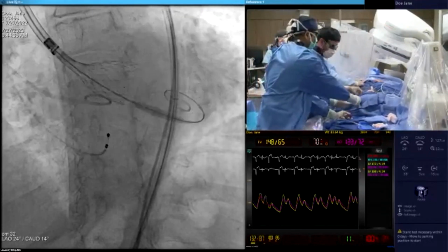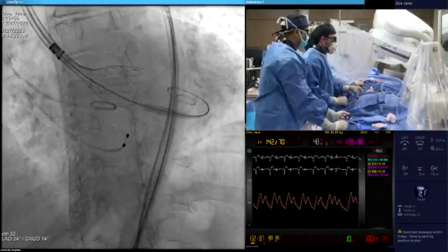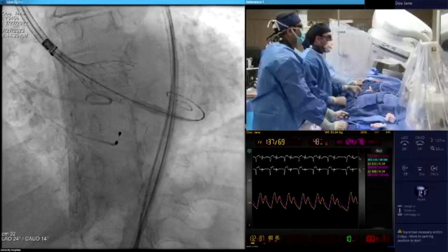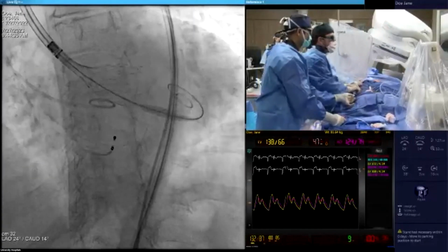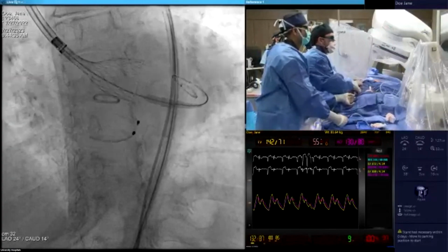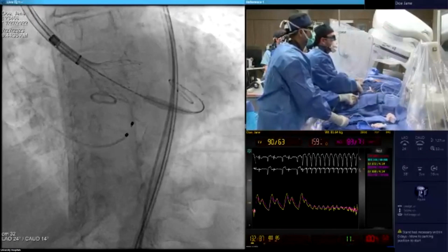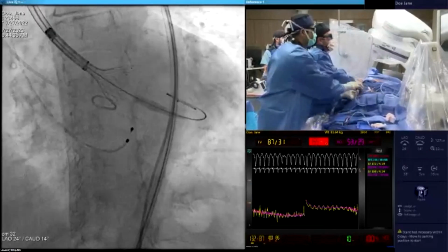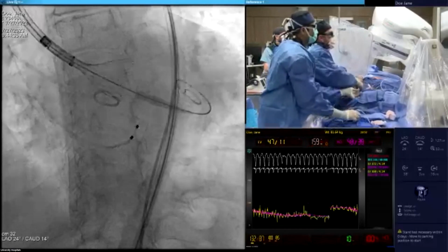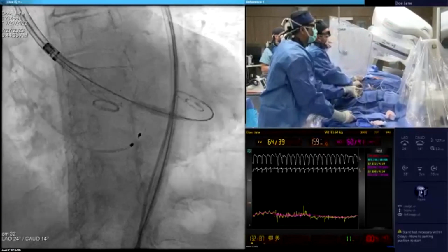I was just gonna say that because that's generally what we do as well. You've optimized on the other projection. Now you're trying to see here and recapture. So your focus is the left side. Yeah. Don't let me lose wire. All right, pacemaker on at 160. No, I still would focus on where the pigtail is because you cannot really understand where. Yeah. Okay. Pacemaker at 140.